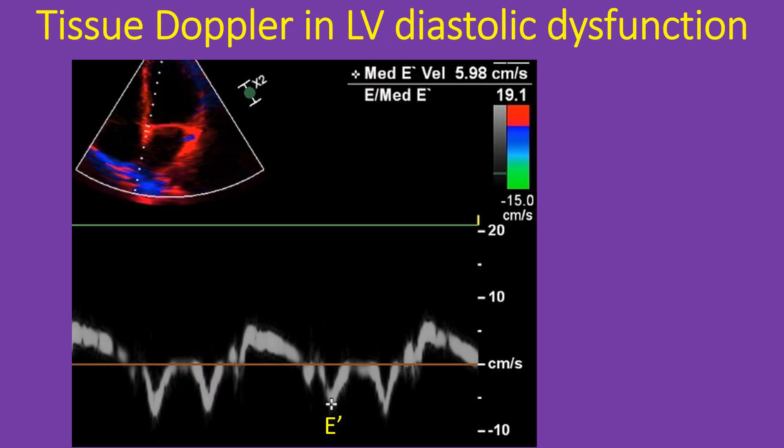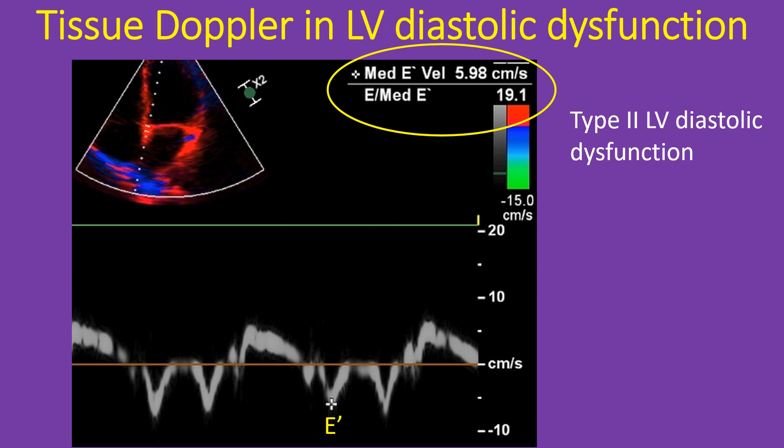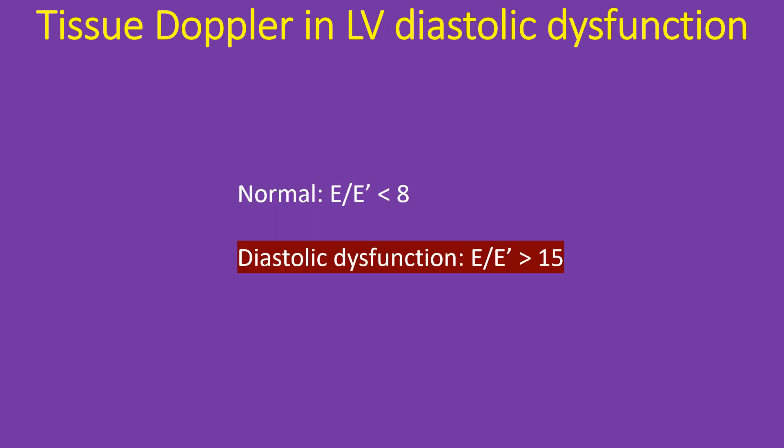Tissue Doppler imaging with colour kinesis in the inset: E by E prime of the medial mitral annulus is shown as 19.1, indicating type 2 left ventricular diastolic dysfunction. In diastolic dysfunction, as relaxation of the ventricle is impaired, the velocity of the medial mitral annulus is reduced so that the E by E prime ratio is increased. E wave is measured prior to tissue Doppler imaging and stored so that the software displays the E by E prime ratio as soon as E prime is measured. E by E prime below 8 is considered normal, while a ratio above 15 is considered a feature of left ventricular diastolic dysfunction. E by E prime has been correlated with left atrial pressure, which is the left ventricular filling pressure that increases in diastolic dysfunction. Estimation of pulmonary capillary wedge pressure from E by E prime on tissue Doppler was covered in another video on this channel.